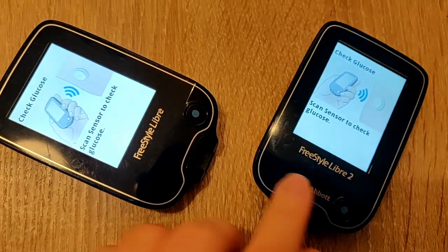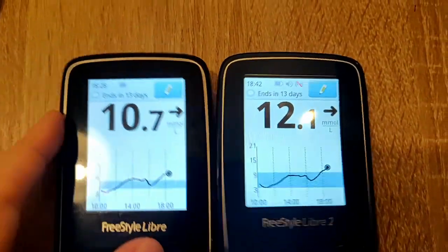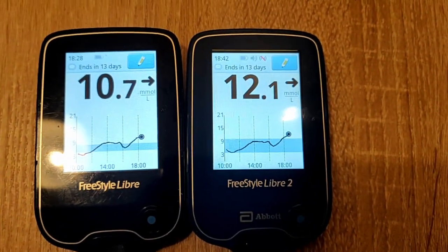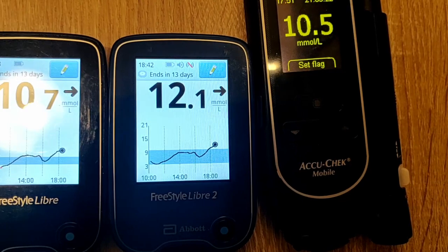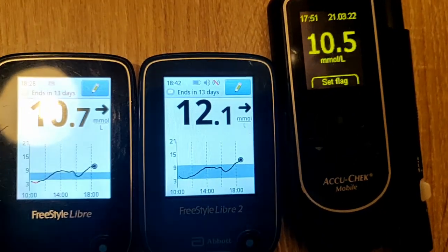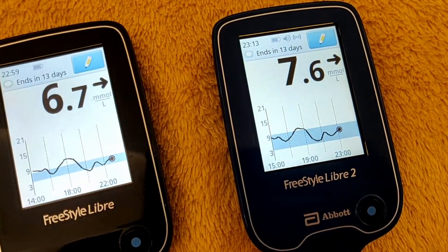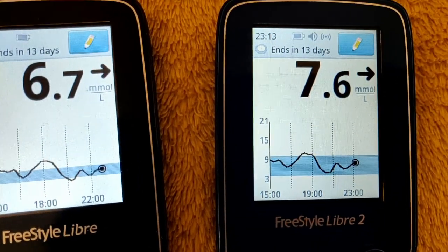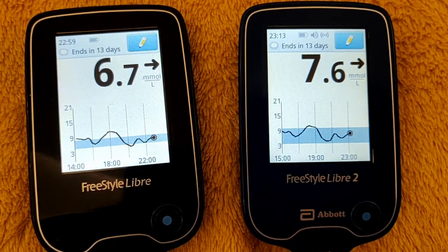Dinner time check. Freestyle Libre 1 says 10.7; Freestyle Libre 2 says 12 — that's a notable difference. Checking on the real monitor: it's 10.5. So the Freestyle Libre 1 is more accurate at the moment. I need some insulin; I've had a stressful day with work so maybe that's why I'm going high. Before bed, Freestyle Libre 1 says 6.7 and Libre 2 says 7.6 — both around the same. The day graphs are pretty much the same shape.